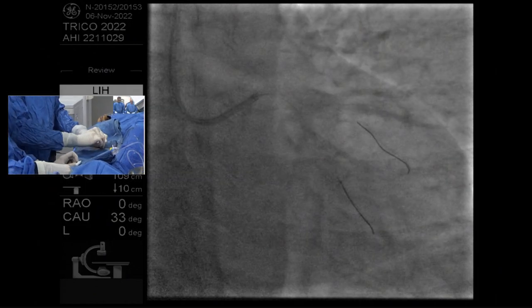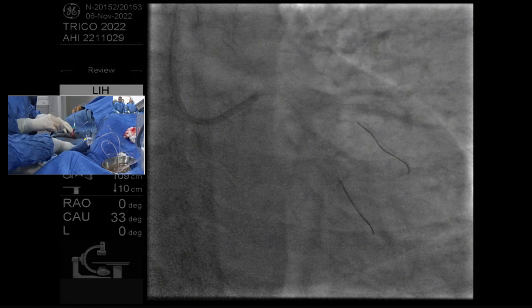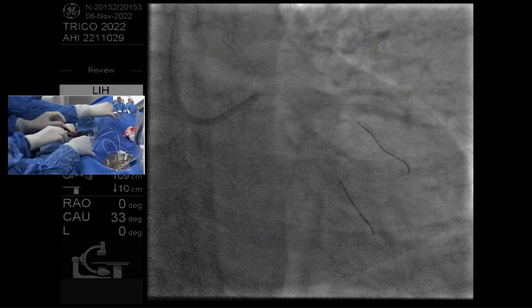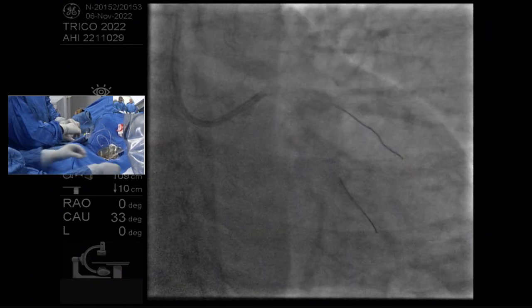So what you've done now is you've come around the curve, but it's not knuckled, so you're going to sit on the lesser curvature. I'd bury your first wire a little bit more if you can, just so that you have the tip into something very, very safe because your IVUS is there.